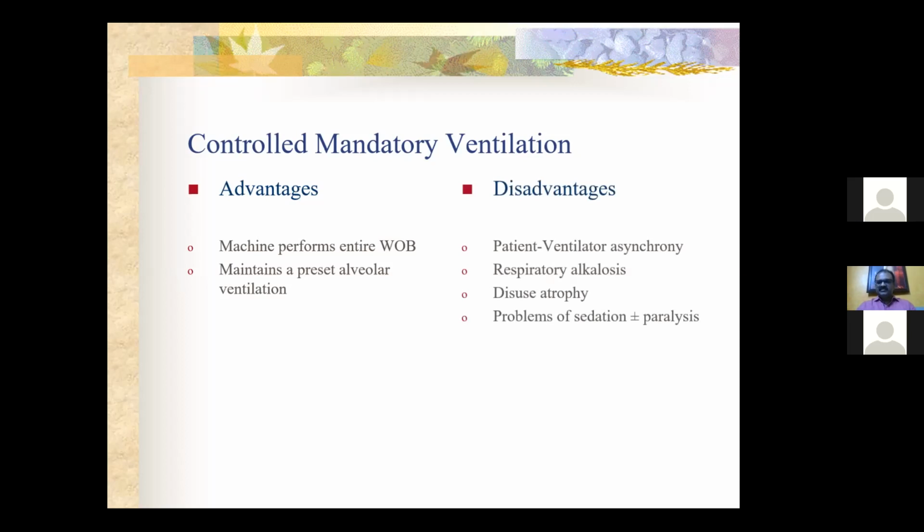Disadvantages is basically patient-ventilator asynchrony. If it's only the controlled mandatory ventilation and the patient tries to breathe in between, the machine will not start an assist control, it's only a controlled mandatory. So when the patient tries to breathe in, maybe the machine might not give the respiratory gas for the patient to breathe in, because it's only controlled mandatory.